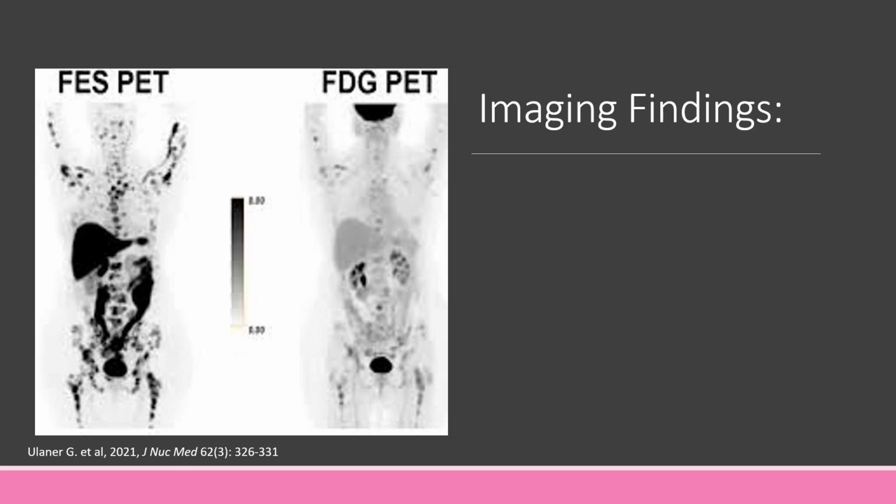You see that this patient will probably have a better prognosis and will greatly benefit from hormone therapy because almost all of their lesions are estrogen receptor positive and not very much is really seen on the FDG.